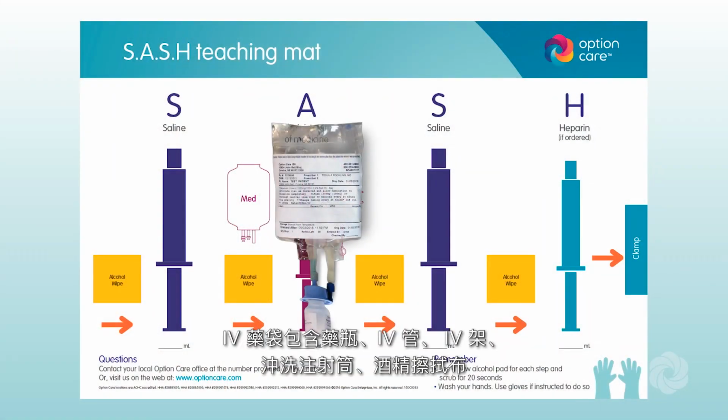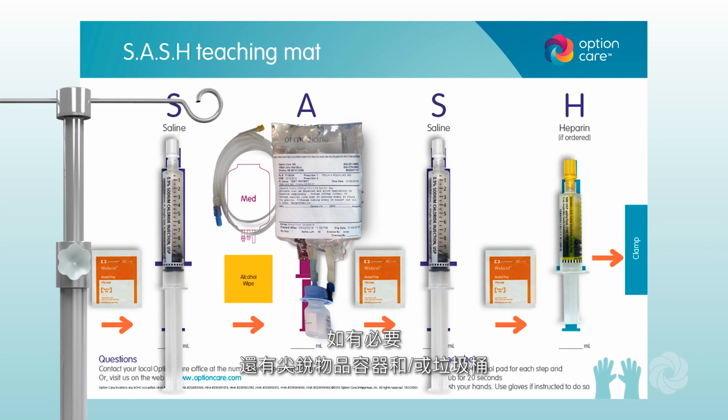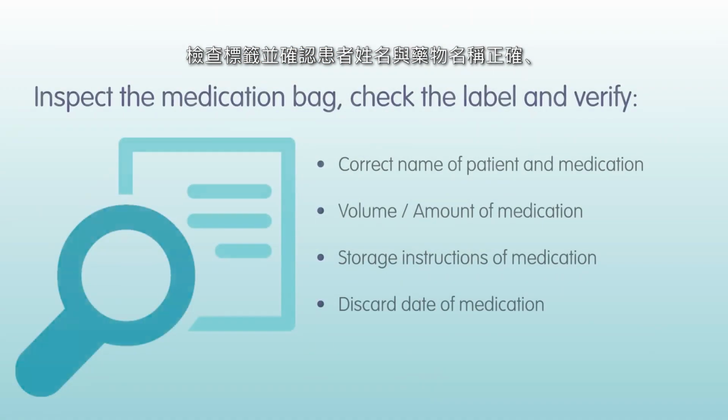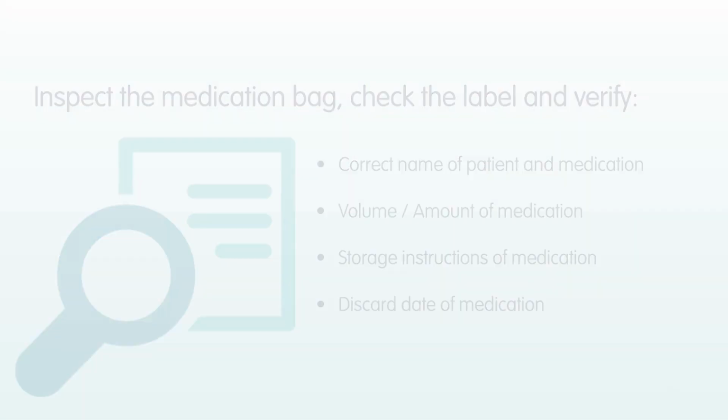IV medication bag with vial, IV tubing, IV pole, flush syringes, alcohol wipes, and if necessary, sharps container and/or trash container. Inspect the medication bag. Check the label and verify: correct name of patient and medication, volume, amount of medication, storage instructions of medication, discard date of medication.